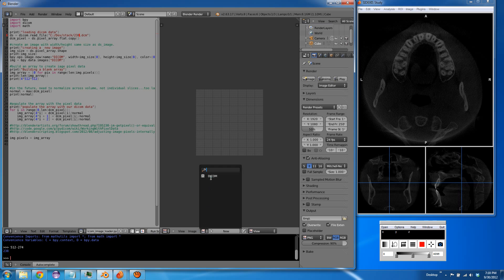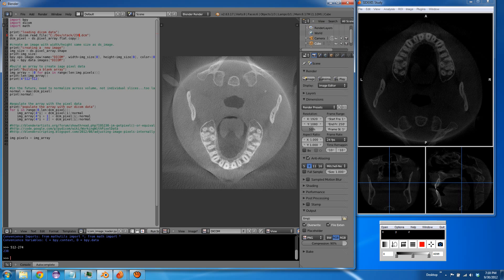That's quick. Ta-da. So there we've read some DICOM data in Blender in a format that's useful.